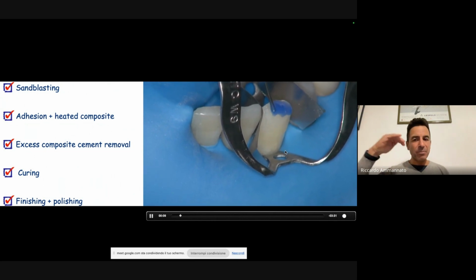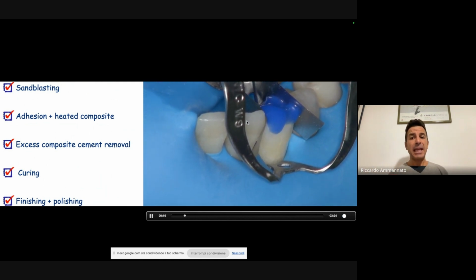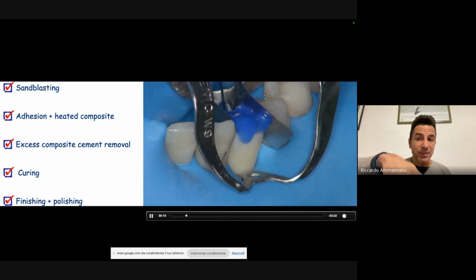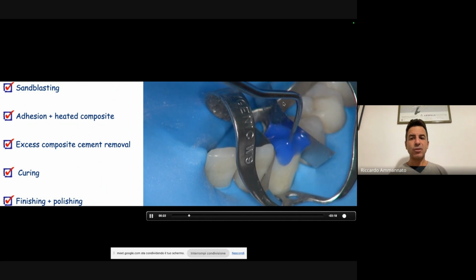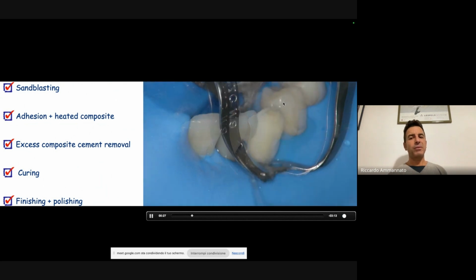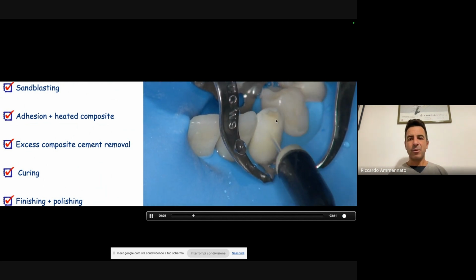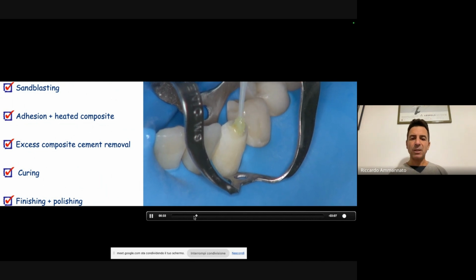And again, same procedure also for my veneer on the canines. So it's an incisal veneer that wraps also on the lingual side. Okay, so only a 45 degrees bevel, as I shared with you on the previous case, that is performed on this area right here, right there. So adhesion.